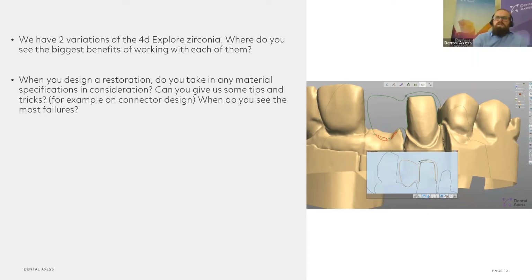Okay. And is that the same for you when you do that, for example, in an incisor? Sometimes you get preparations in an incisor that are very sharp, and that's something we would love to avoid when working with ceramic cases. Yep, I agree. Sharp edges in general are something you want to avoid. They create stress points, and like you see on this one, the fracture will probably be right on that corner where it transitions to a thin point. So yeah, avoid sharp edges in general. That's my philosophy. No, I definitely agree with you.